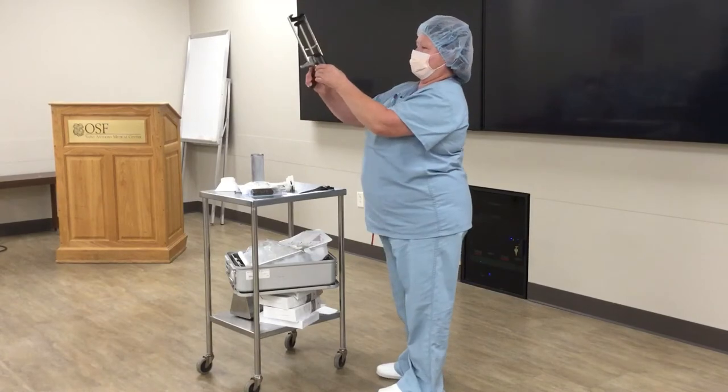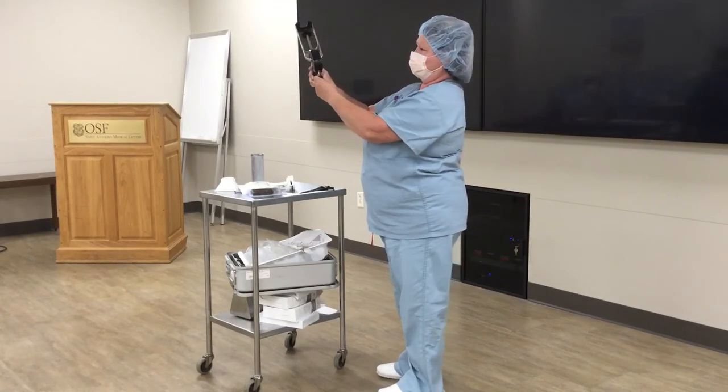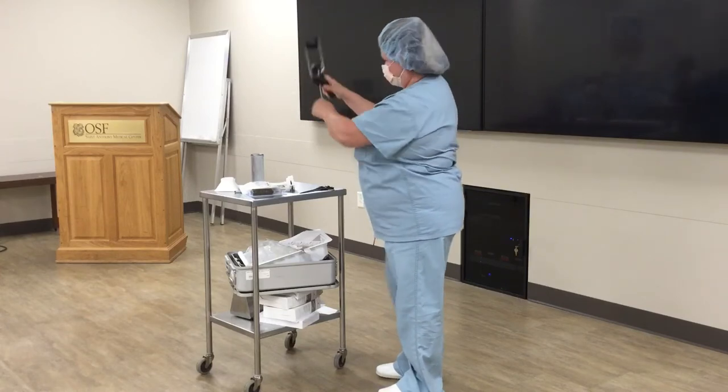So this is the gun. The first thing you want to do is pull this back. A lot of times it comes somewhere in here. There's a little switch back here — you just pull this back.